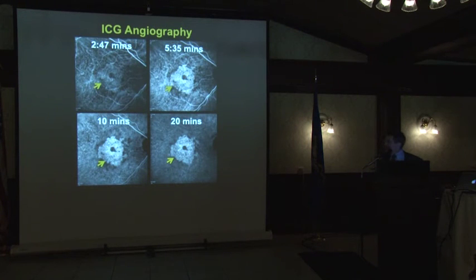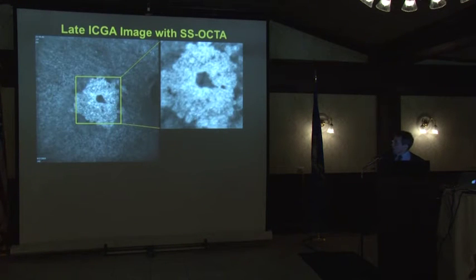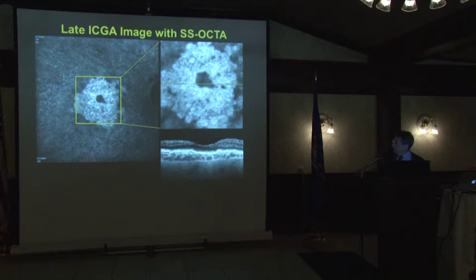All right? This is that plaque blown up to the 3 by 3 millimeter central area. Let's look at a B scan through this region. All right? And here's the color-coded flow. And what you can appreciate here is that there's pink under the RPE, above Bruch's membrane. That shouldn't be there. Remember, all the circulation is below Bruch's membrane and above the RPE. Nothing should be between the RPE and Bruch's membrane. And notice the center area is spared.